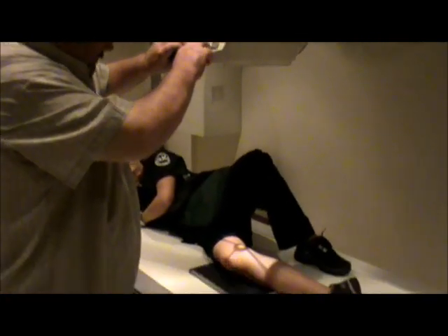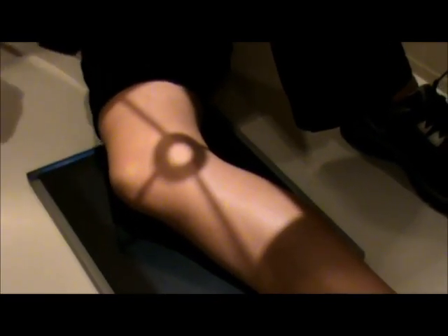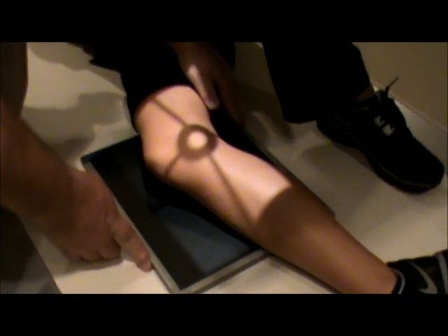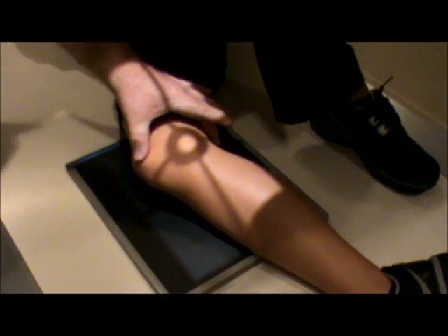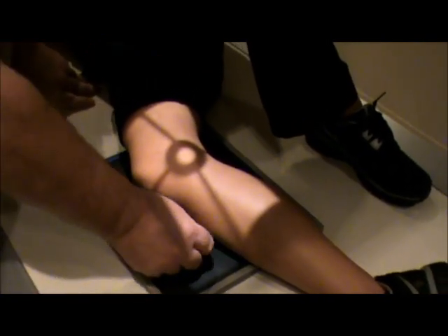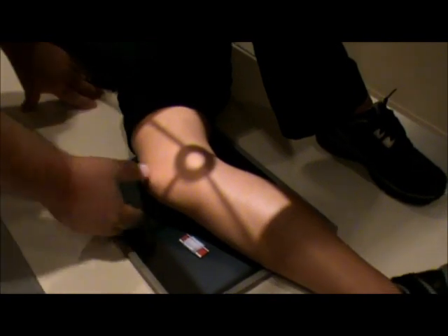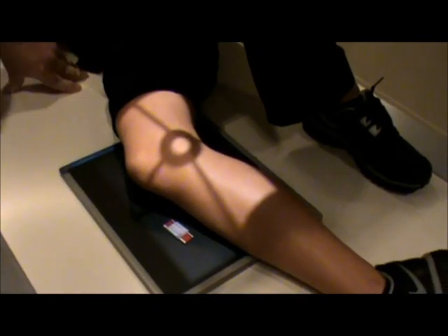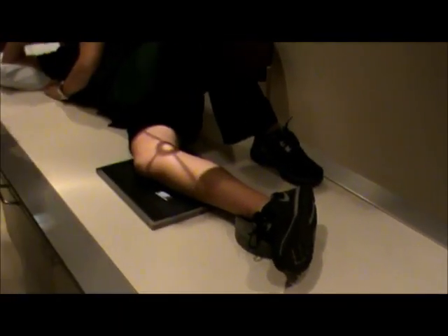Our centering is going to be one inch inferior to the medial condyle. Our collimation is going to include four-sided collimation — we are centered to our film and we want to make sure that we're to the skin margins. We have plenty of room here for our marker, which is in the light field but not obstructing. You can put a sponge under the ankle to help keep it in a lateral position.